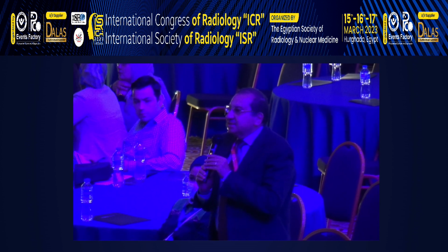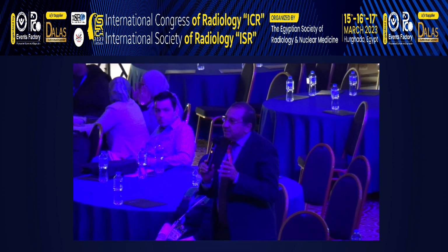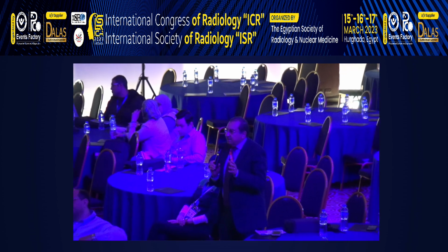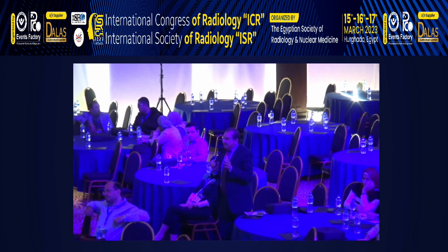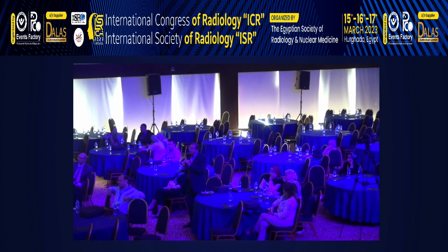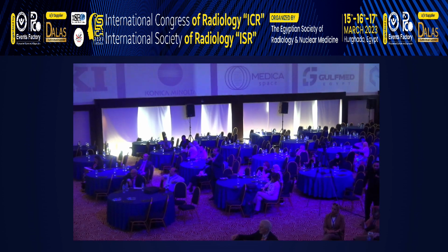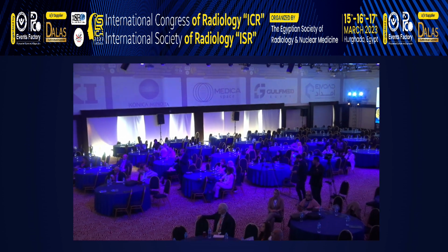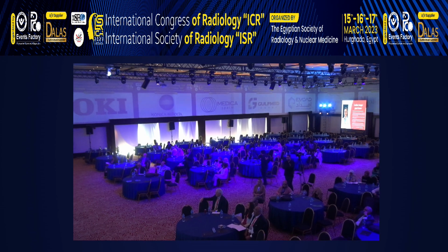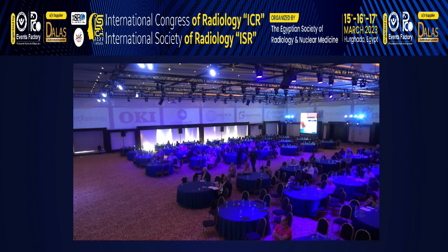So I think that, seeing this, we were diagnosing case 6 as a non-neoplastic process. In fact, it was an astrocytoma grade 2. I'm just asking your initial diagnosis in that case. Was that a tumor? And really, how do you differentiate in such tricky cases? Thank you again.